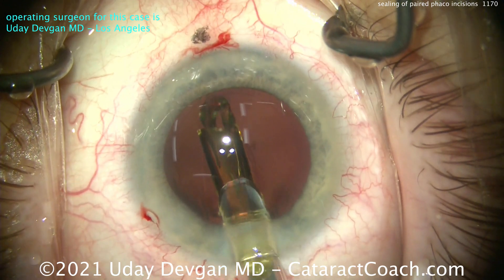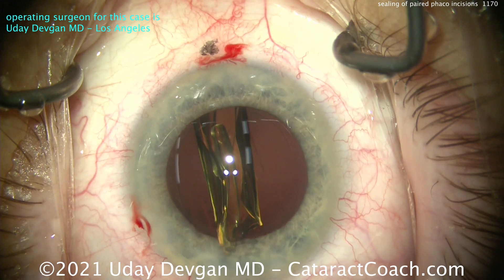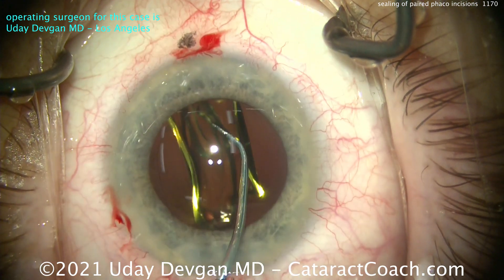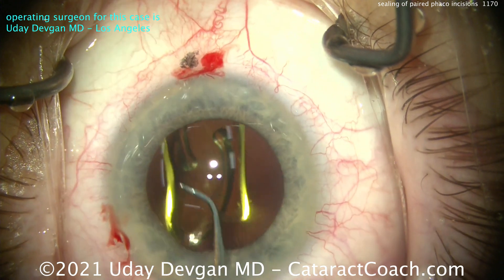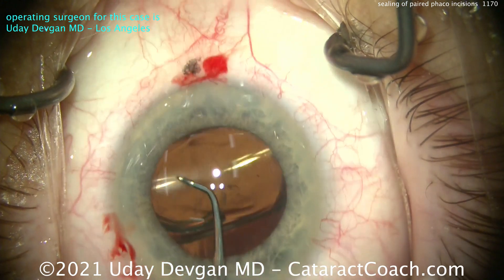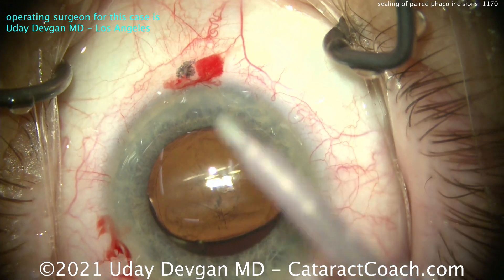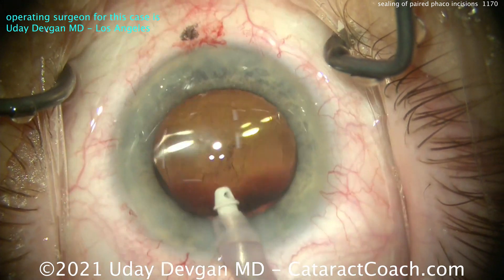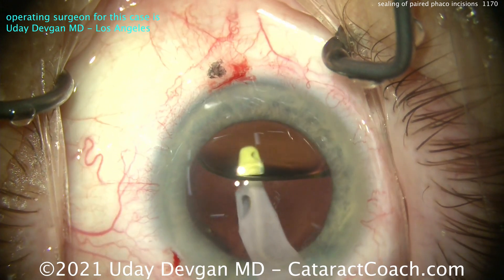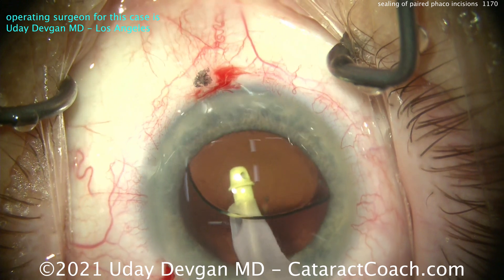Here comes the lens — put that in the eye. Obviously we're showing you the whole cataract case here — a very efficient case, only about five minutes or so. There's the IOL going in the capsule bag; get that dialed in appropriately and let those haptics open up. For removal of viscoelastic, we're going to see no leakage from that incision. Remember, inserting the IOL itself can very significantly raise the intraocular pressure — but yet, look, no issue at all.